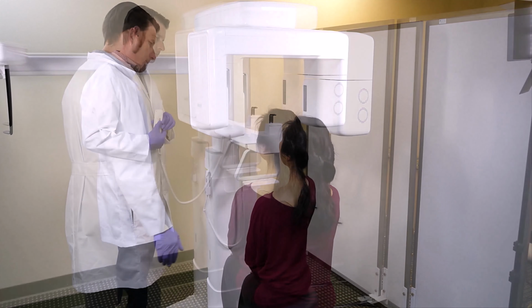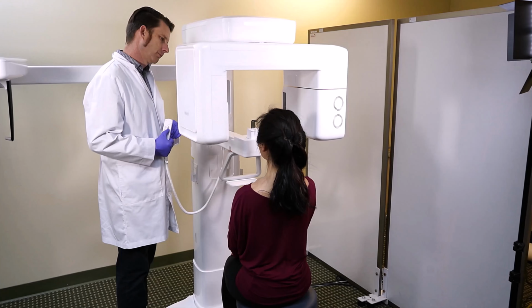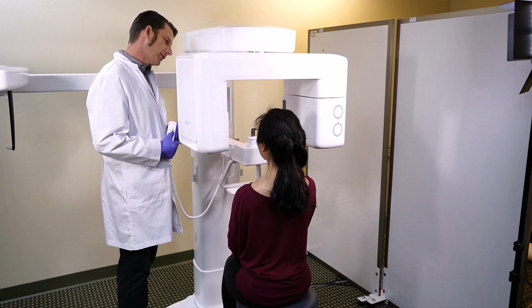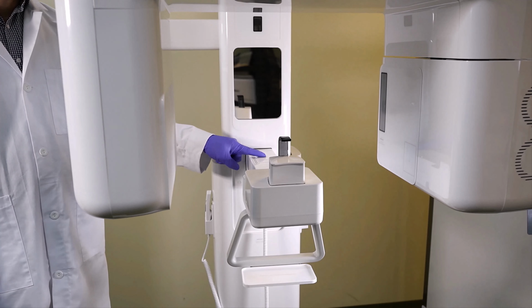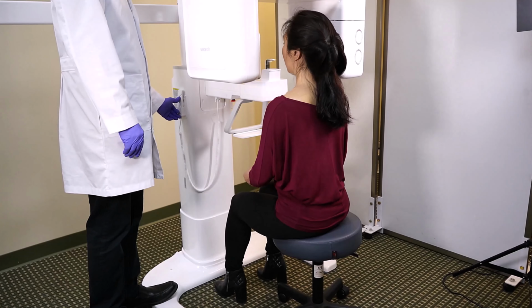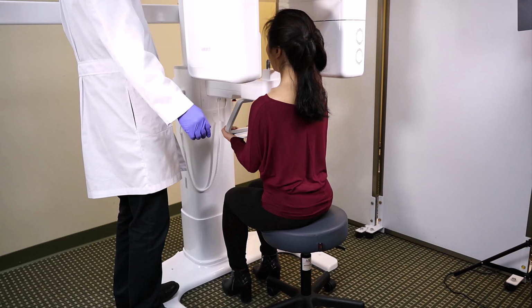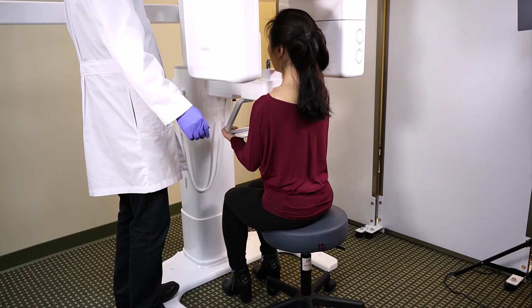Adjust the chin height approximately a ½ inch under the chin by using the column up and column down buttons on the hand switch on the side of the device. Alternatively, you can use the buttons on top of the horizontal arm in front of the mirror as well. As you have the patient roll into the machine, have them hold the handrails with their palms facing up. Keep the feet at shoulder width apart for stability.